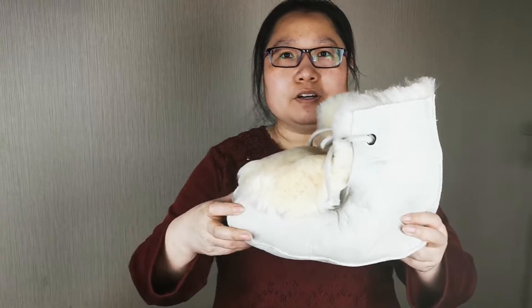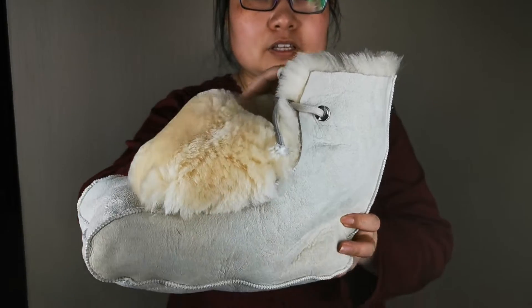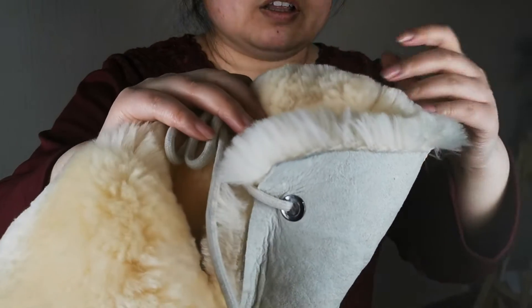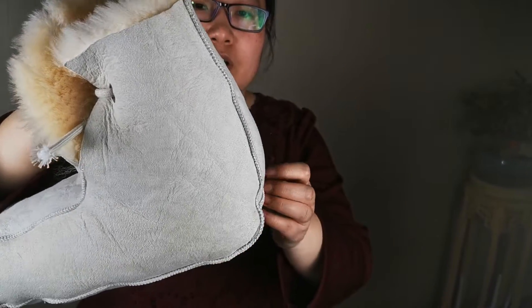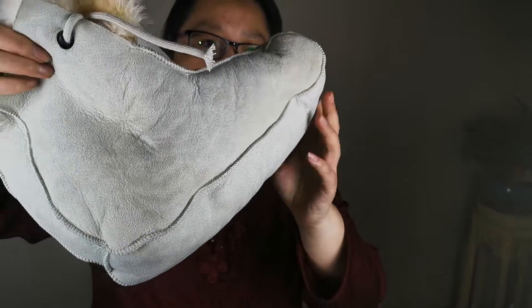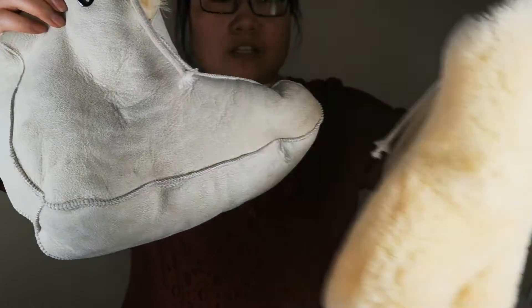This is for the heel protection boots — medical-grade sheepskin, hypoallergenic, and water-absorbent. This is for patient use. The whole boot is cut and sewn from real sheepskin, as you can see.